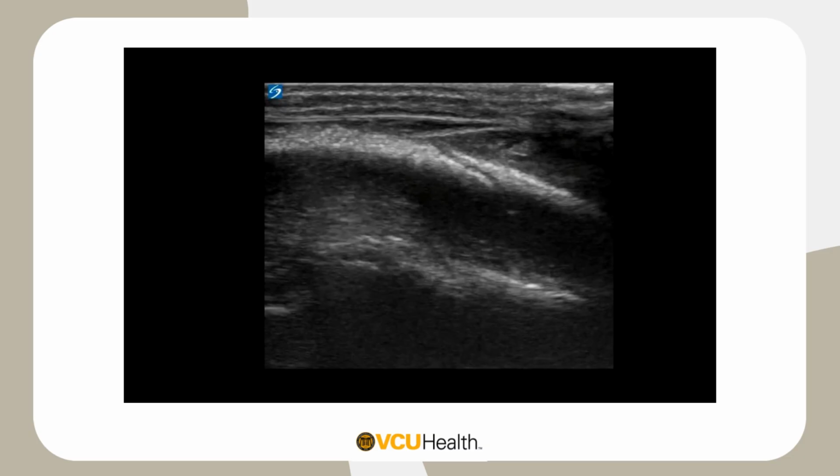On top of that, you will see a hematoma, which is an indicator. Here the arrow points to the fracture line, and here is the area of your hematoma, which is over the fracture line.